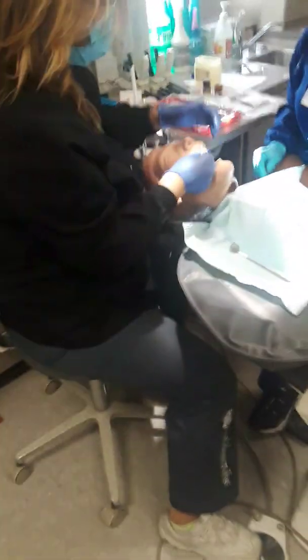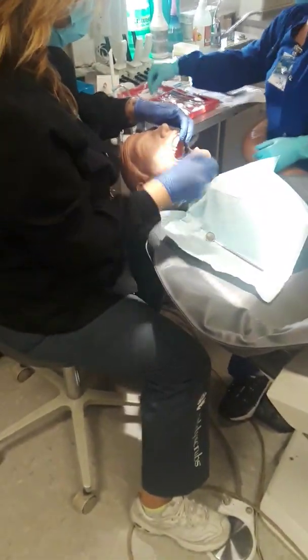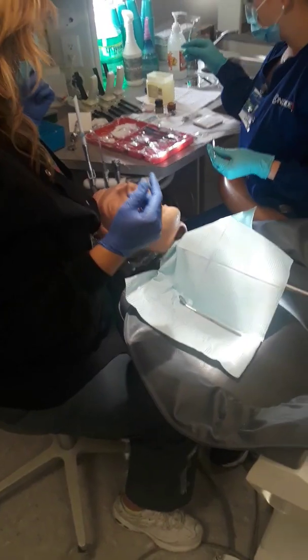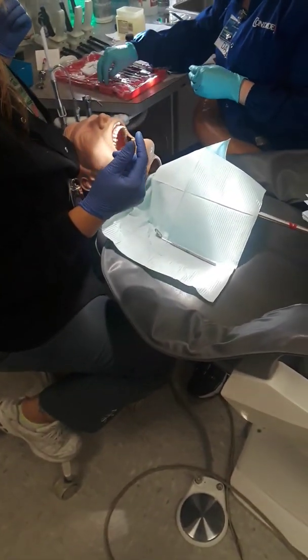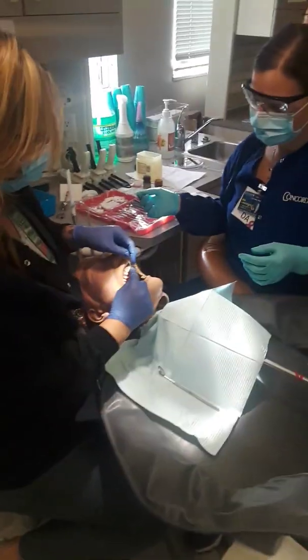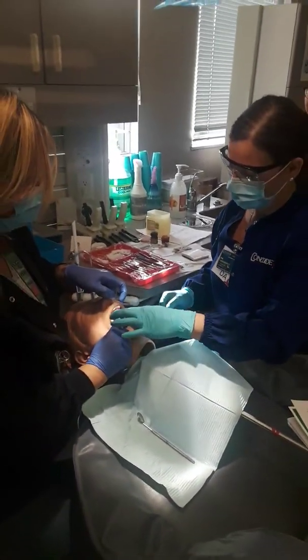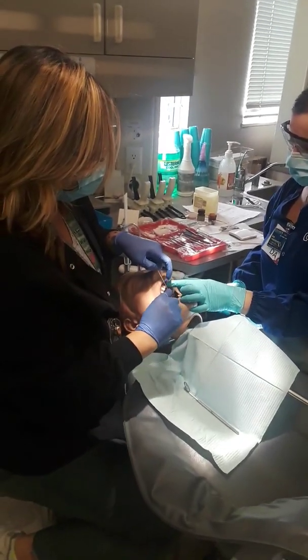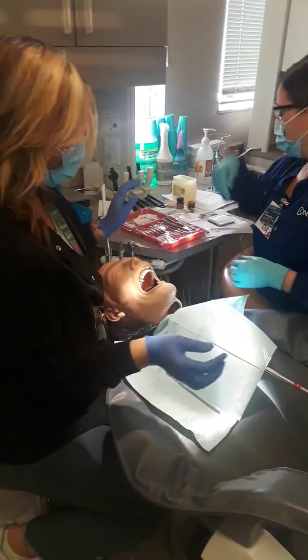We'll put it in. We gotta make sure we have our checks. So we have 3 checks. Our first check is gonna be our contacts, because if it's too tight, it won't go all the way up. My assistant's gonna assist me when I put my floss there. She's gonna hold my crown. I'm gonna check for a click, both mesial and distal. Contacts feel great.